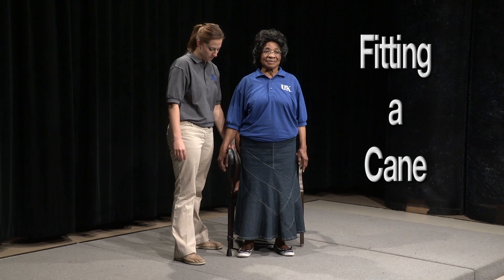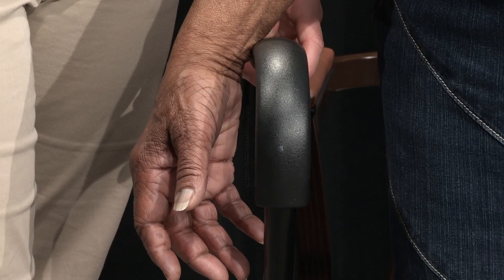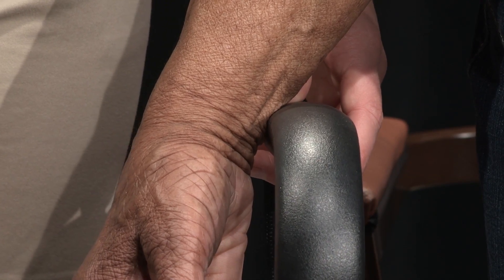To properly fit your cane, begin by standing comfortably up tall, feet shoulder-width apart while looking straight ahead. Place the cane on the side that is stronger and drape your hand over the outside of the hand grip. The hand grip should be at the level of the wrist crease. This allows for a slight bend in the elbow while using the device.